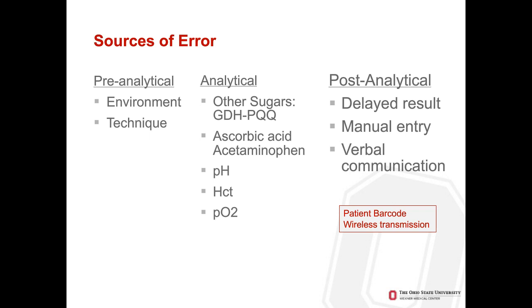Post-analytical errors are really a result of just inadequate coordination and timing of those results. And it might mean that it could be attributed to the wrong patient, it could be a transcription error, there could be a verbal communication error. And in particular, these types of errors can be addressed with better technologies such as patient barcoding and wireless transmission.